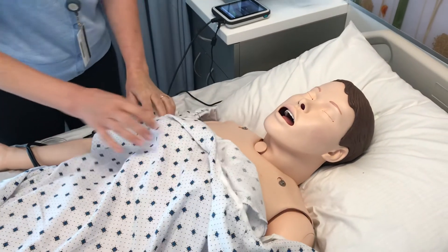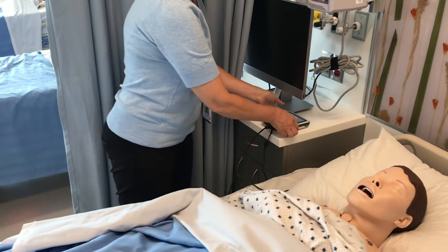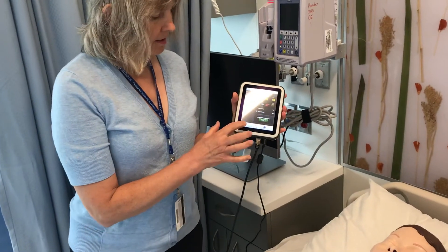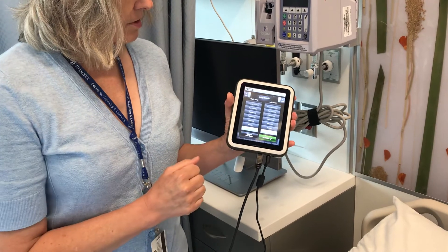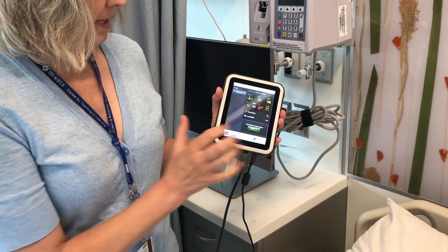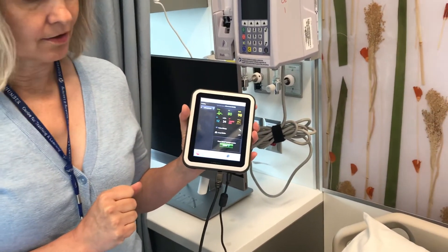So for now, I've got the mannequin running on respiratory lung sounds — we're listening to wheeze. To change that, I go back to my SimPad Plus and press lungs again, then lung sounds. I'm going to choose this time a stridor, so I'm clicking on there and hitting activate. In a moment or two, you'll be hearing stridor sounds.